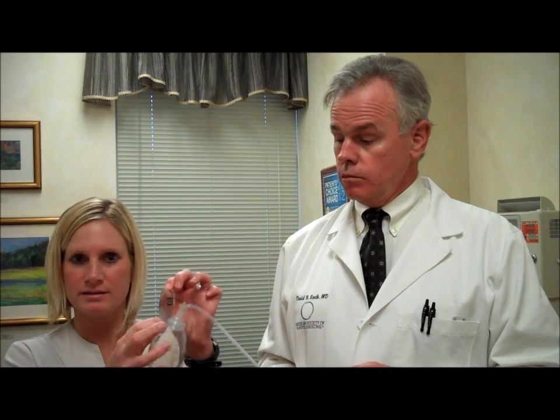Another thing about the drains is figuring out how to secure them, because you're not always going to walk around holding them. And again, Mandy has some very helpful tips. What I recommend is to use a safety pin, and you can put the pin in this little plastic area here, and you can pin the drain onto the bra to help hold that up. And then when showering, I usually recommend getting a shoestring and looping around and making a little necklace, tying it around your neck to keep it elevated while showering.